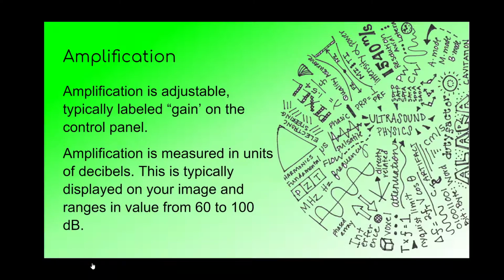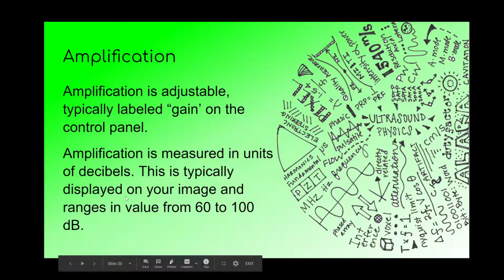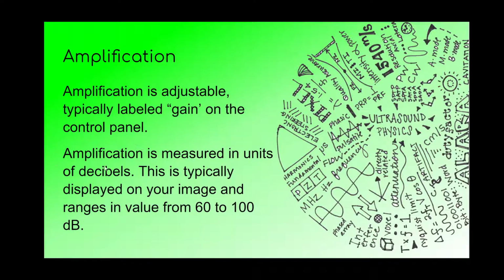Amplification is adjustable. Typically it's labeled on our machine as gain. I'm sure you've used it quite a few times already at this point, but that is the knob that tells the receiver to amplify the signals that are coming back from the body. Our typical values for amplification range between 60 to 100 decibels. And again, remember that amplification is measured in decibels, so it's a change, a ratio of numbers.